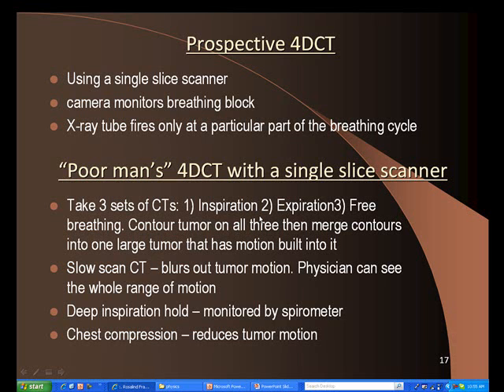That's okay, but what you capture also depends on where the tube is. That's not a great way of doing it either, because the tumor might be down here, and the tube's coming around here, and as it comes up here, the tumor's here. So when it reconstructs it, you don't know if it's reconstructing it down here or up here, or is it catching more of the motion here than it is here based on how it's reconstructing. It's not a great way of doing it either. But it's better than this one. It blurs it out. And actually, I have a little experiment that we're starting to come up with the best CT scan procedure for this, so that you get the whole tumor motion.